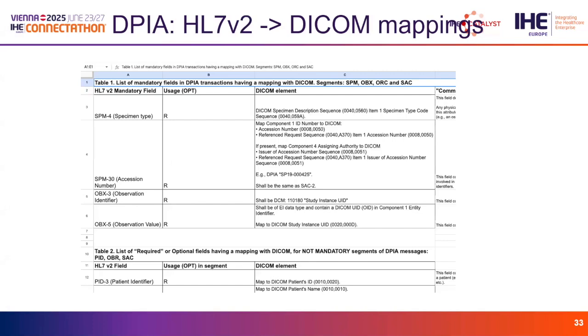There has been a lot of joint work with DICOM Working Group 26 to ensure that all the DICOM objects produced have the minimal set of required metadata, so that we are not producing non-compliant DICOM objects.